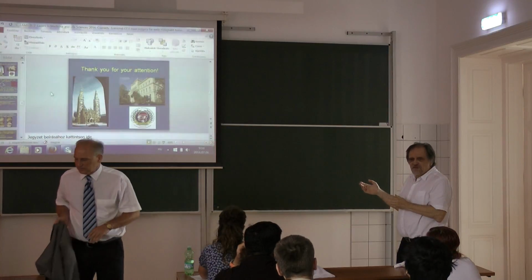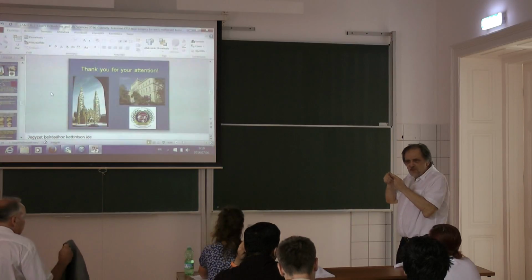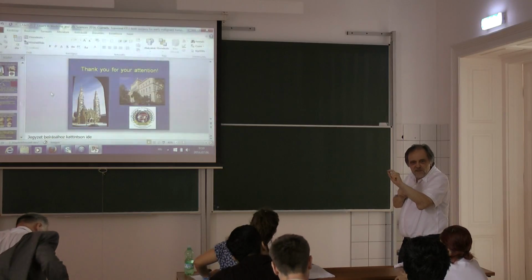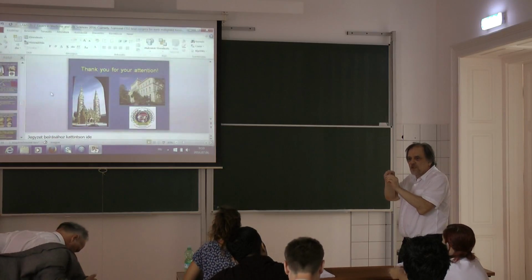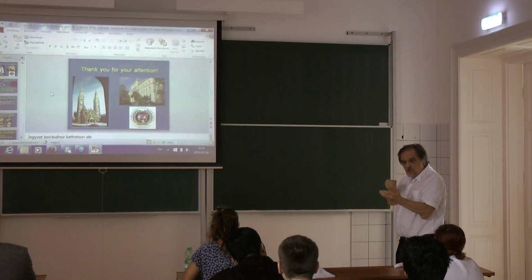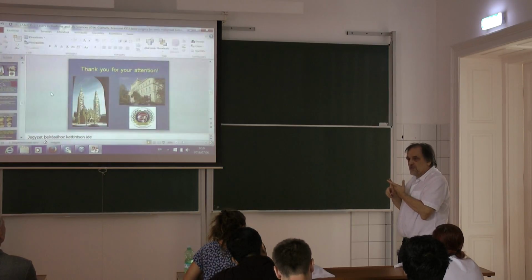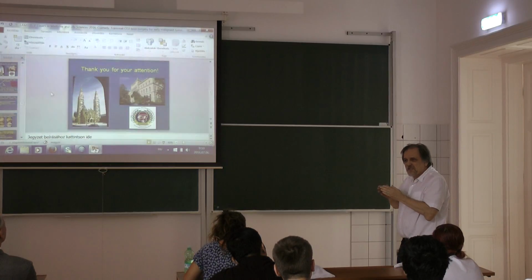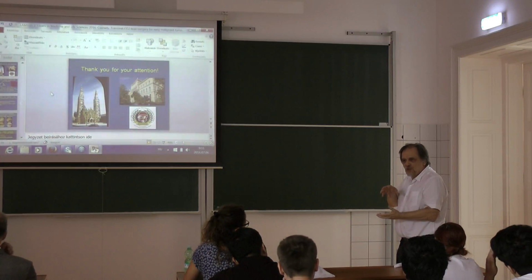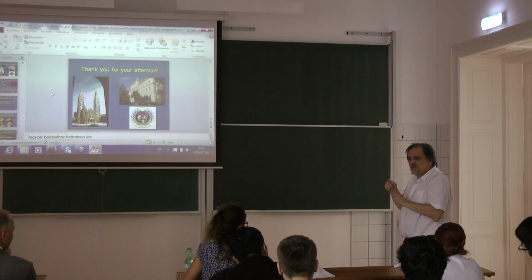After this presentation, you can find some goals, yes? Some very specific goals. Microsurgery, because we can do it for each side of the endoscopy. Sometimes the spot is less than 2 millimeters. You need to do some very, very small surgery. We don't have contact between the knife and the tissue. It also sometimes is a very good output. We also have some information about the carbonization zone. It means if we have an interaction between the tissue and the laser, how long, how deep, how strong, whether we can use it wider or smaller.